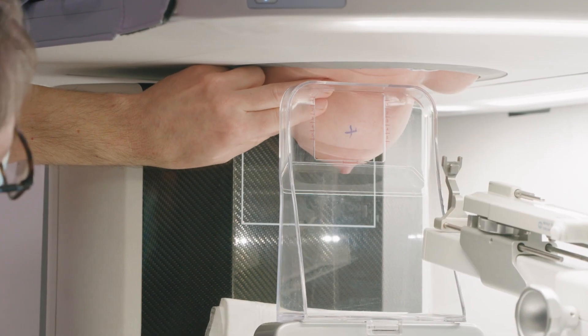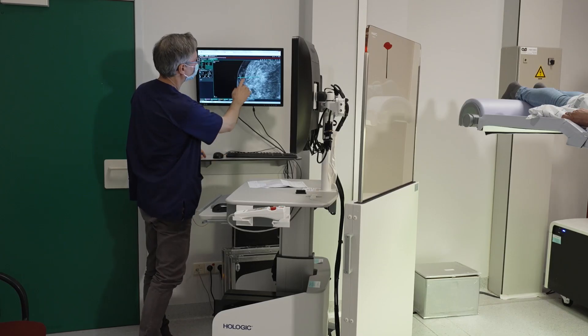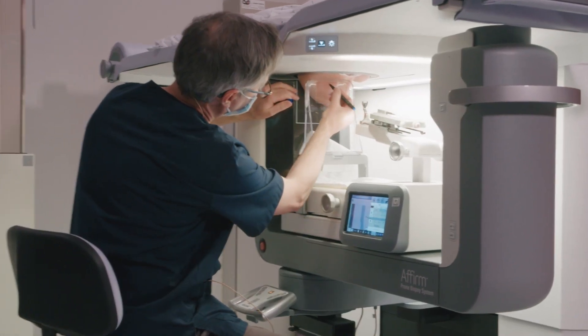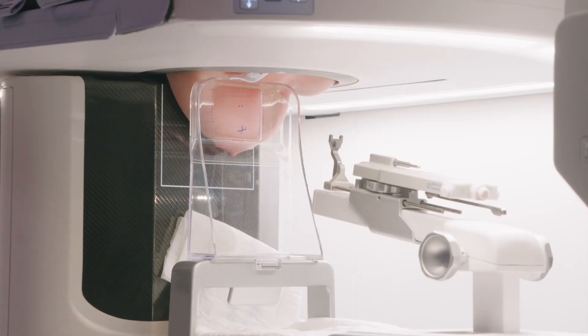I compress the breast slowly. We start with a scout view to locate the microcalcifications. Once we can image them in the center of the image, we make a tomosynthesis of the breast.